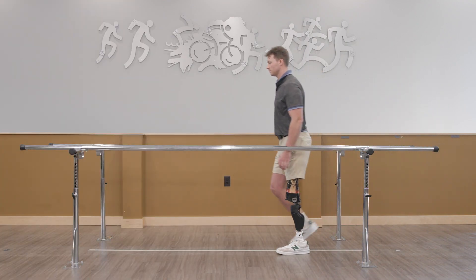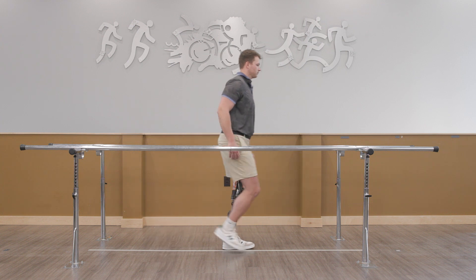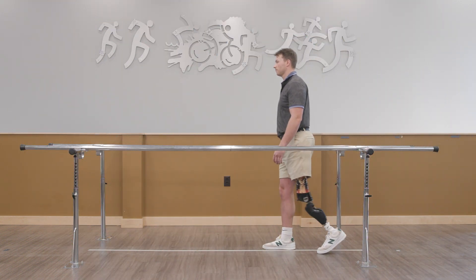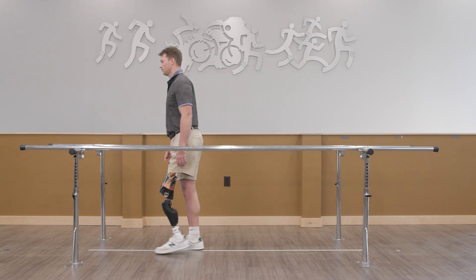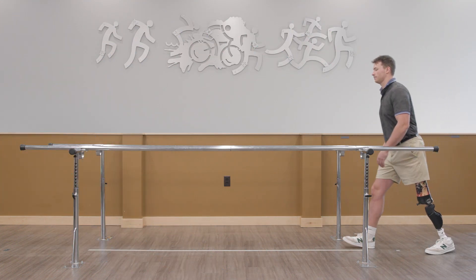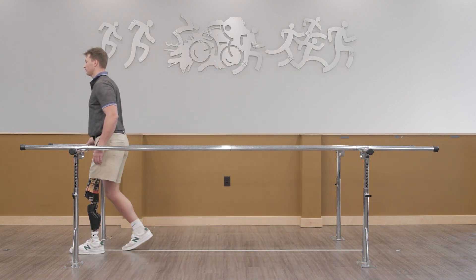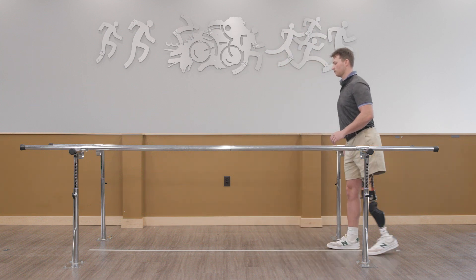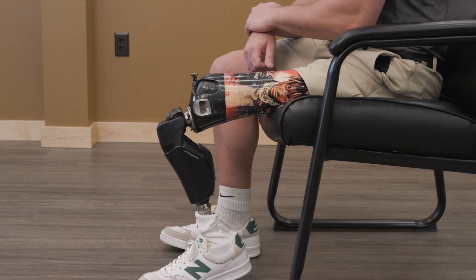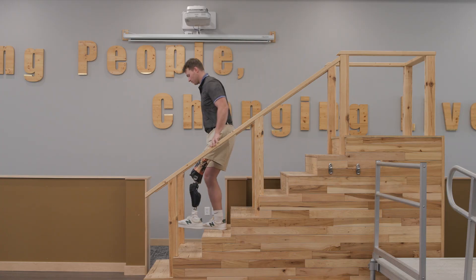Continue to evaluate the resistance settings with the end user in various scenarios. It is important to note that there are no separate resistance settings required for normal walking versus stand-to-sit actions or on stairs and ramps. We recommend walking at different speeds plus additional actions such as walking backwards. It is also very important to evaluate the stance flexion resistance when sitting in a chair and walking up and down stairs and ramps.